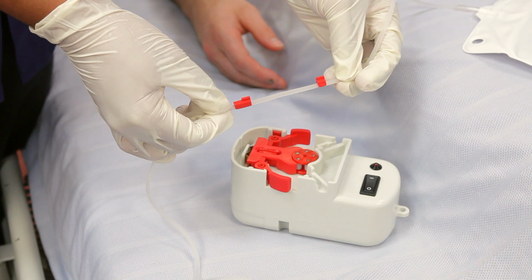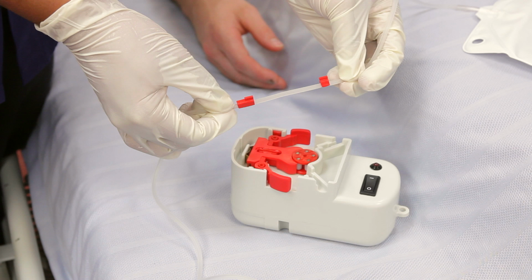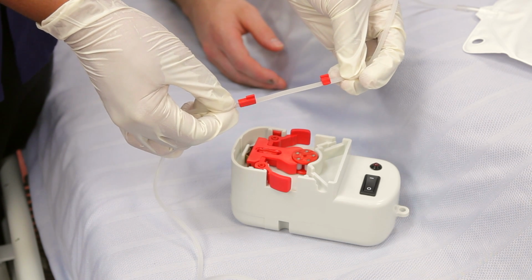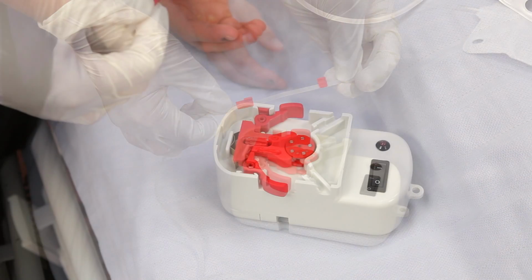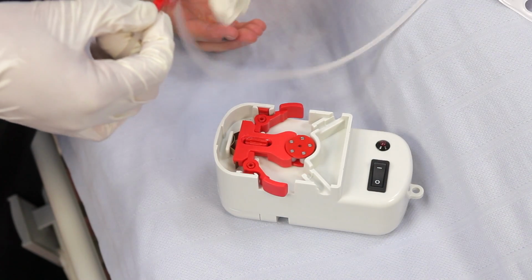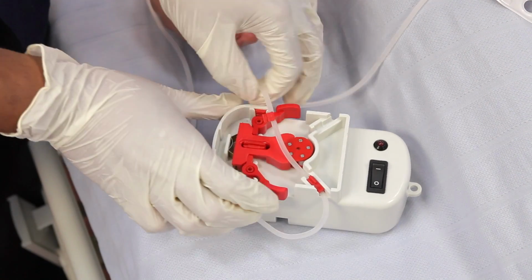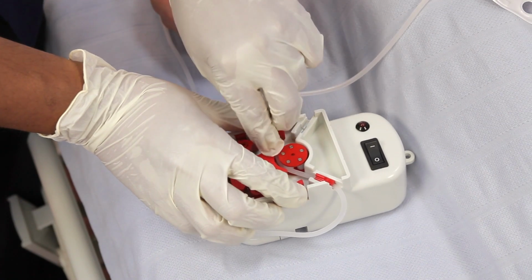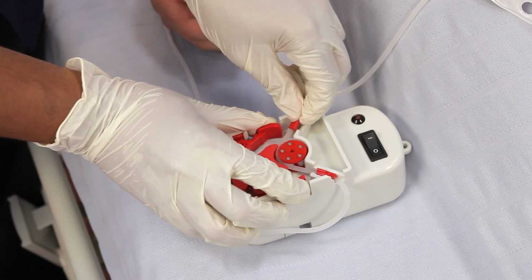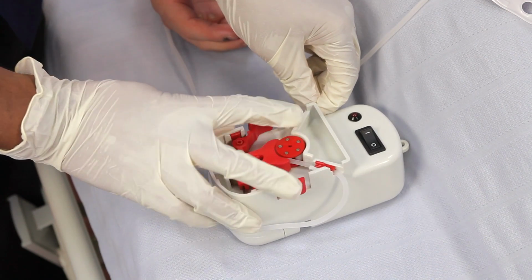Finally, take the LiDCO flow regulator, identify the retaining lugs on the blood collection bag tube, and insert them into the matching positions on the flow regulator as shown. Fit the longer lug first. Squeeze the tension levers and wrap the tubing around the rotor. Fit the smaller lug and release the tension lever.